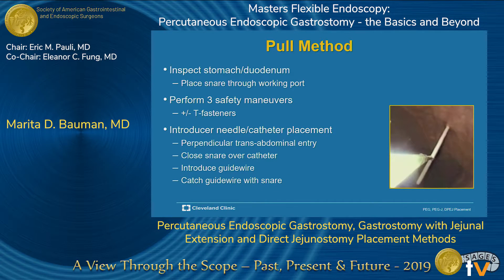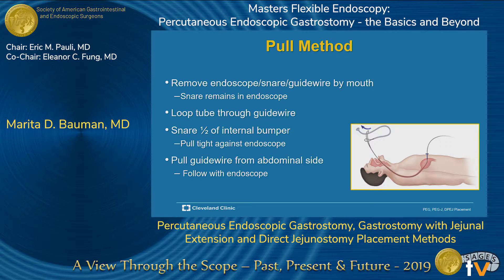Starting with the pull method — just as with any other endoscopic procedure, you first start by inspecting the stomach and the duodenum. I like to already have my snare placed through the working port. Perform your three safety maneuvers, then use your introducer needle and catheter. As soon as that's placed into the stomach, I like to snare it immediately — snare it tightly, remove the needle, and then introduce the guide wire. Loosen the snare just a little bit, then grasp the guide wire. You then pull your entire endoscope, guide wire, and snare complex out of the mouth.